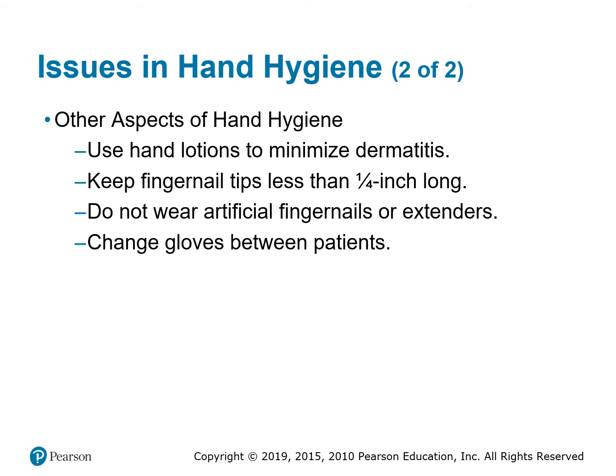It's not wise to always use lotion, even though, yes, I know what you're going to say. We wash our hands so much, our hands get dry. Yes, I know. We try not to use lotion because lotion can sometimes degrade the gloves because of what's in the lotion. If you need to lotion your hands, the hospital sometimes has a specialized lotion that's not greasy and doesn't have any fragrance. Sometimes it doesn't smell so good, but it's lotion. It does the job it needs to do. But we try not to lotion so much because it makes it hard for us to put on the gloves, even though we're supposed to wash our hands before anyway. But sometimes the hand sanitizer doesn't get all the lotion off either if we can't wash our hands with soap and water. So it's kind of like do's and don'ts.